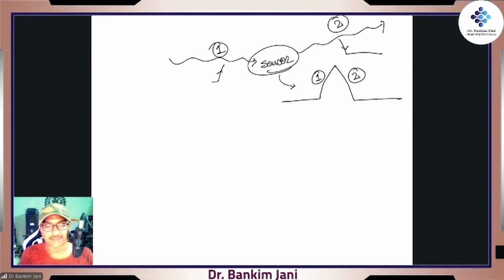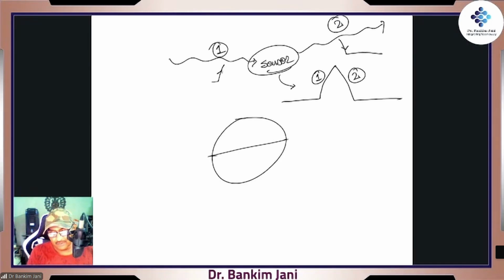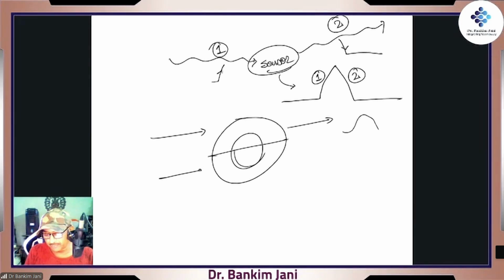This is the simplest explanation. This is how it really goes. So now that would make sense, no? If this is a big area like this, and in a normal heart, as the pulse goes, here we have put the electrode. Our electrode is here. So when the current is coming and when the current is going, it will form this way. But what if there is a heart attack?